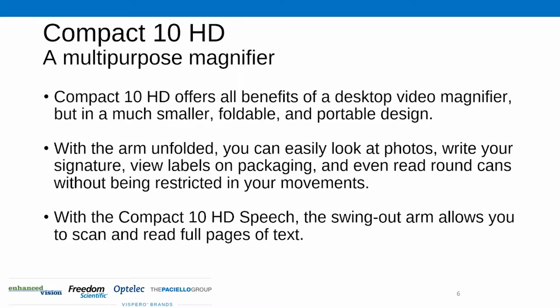So Richard, did you want to chat a little bit about some of these different benefits to the functionality, or the different design of the Compact 10 HD? Yeah, I can do that.